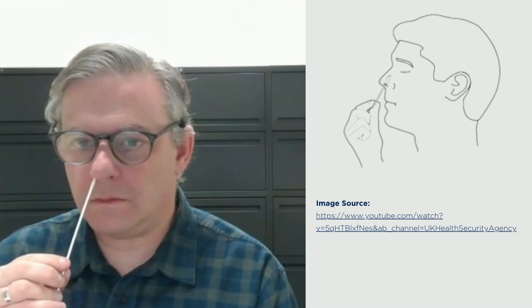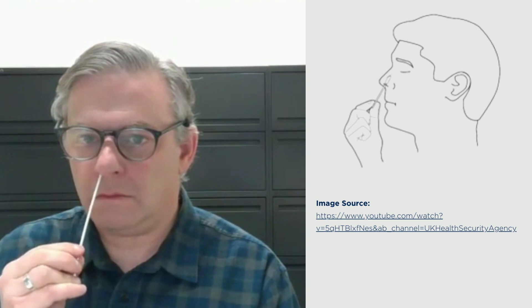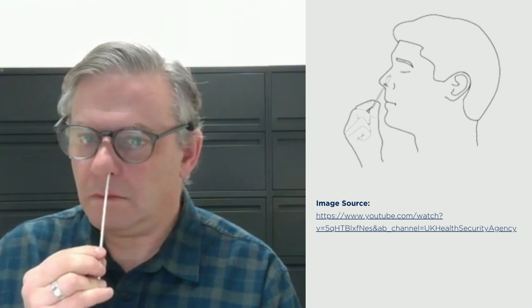Insert the same swab into the front of your nostril about two centimeters and gently wipe around the inside of your nose three to five times. Stop advancing the swab when slight resistance is felt, even if it is less than two centimeters. No force is needed. Repeat in the other nostril with the same swab.